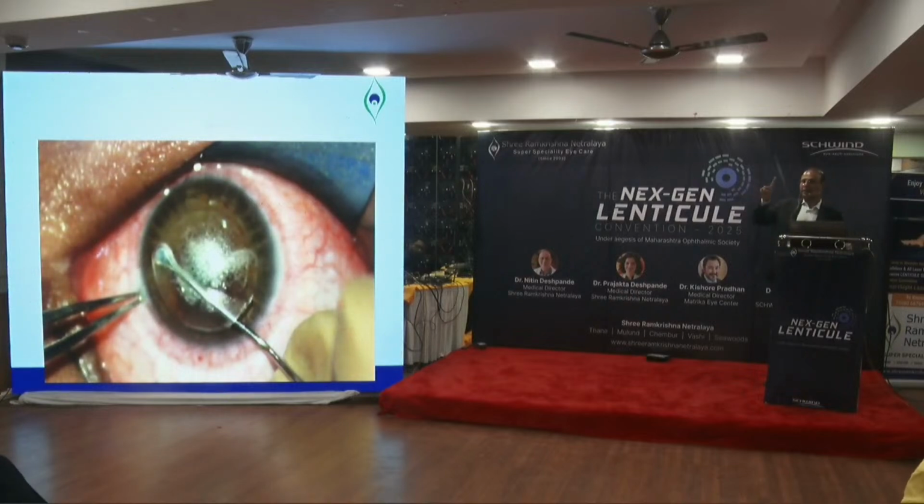You saw what I did. I went tent up, dissected anterior, then I went straight, I dissected posterior, and then I went up again, and when I feel a resistance over the previously dissected area, I'm 100% sure I'm in the right plane. This is very important, because in initial phases, the most difficult thing to do is to identify the right plane. And many times you feel you're in the right plane, but you have already dissected posterior before anterior.